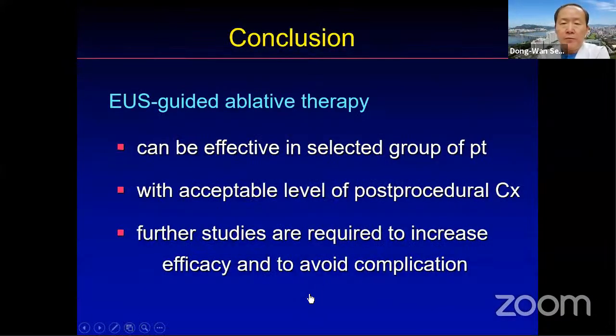Ladies and gentlemen, I'd like to conclude my talk with this last slide. EUS-guided ablation therapy can be effective in a selected group of patients with acceptable level of post-procedural complication, but further studies are required to increase the efficacy, to avoid complication, and for widespread use of this technique.